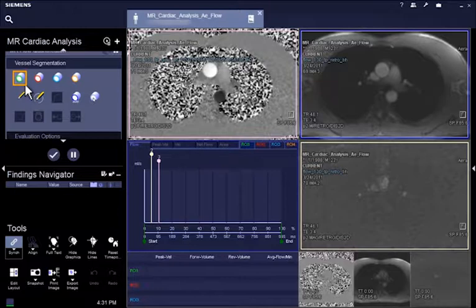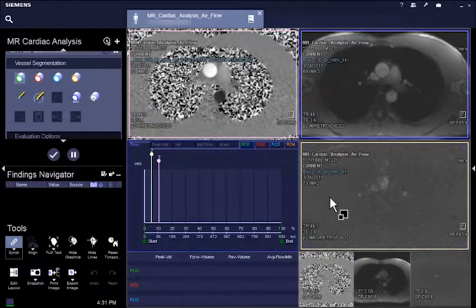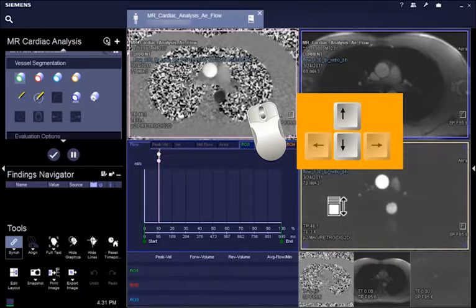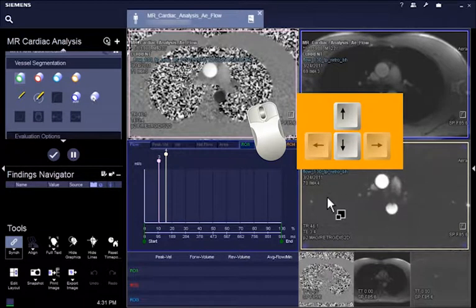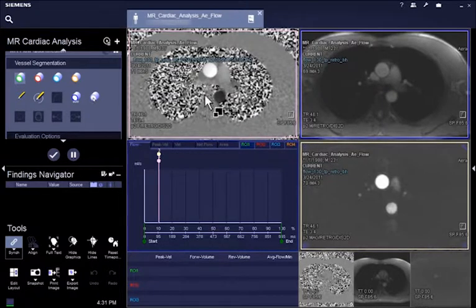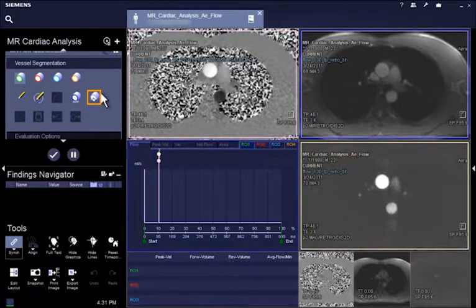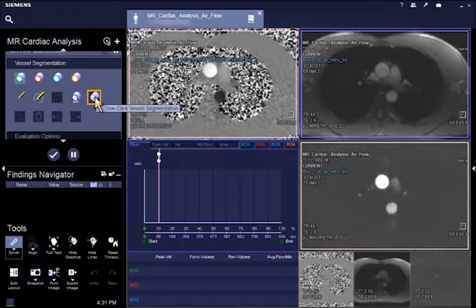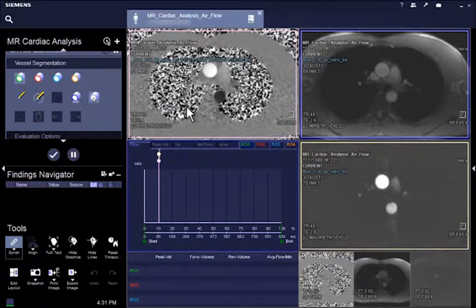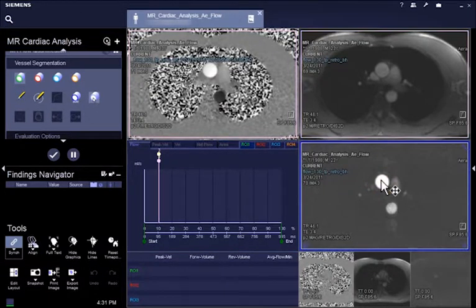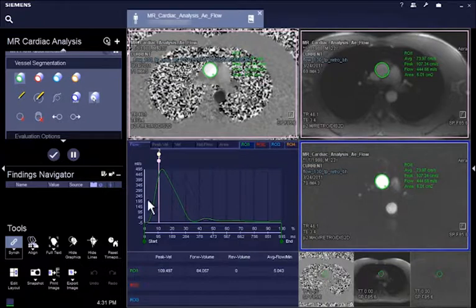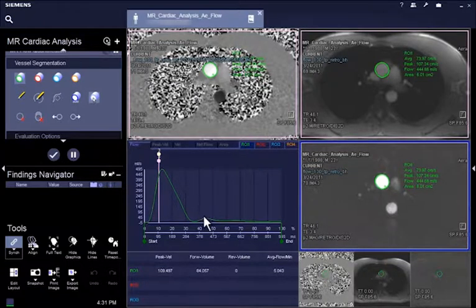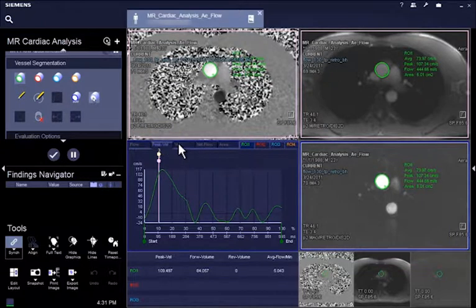All you need to do is to scroll through the relevant slices by using the arrow keys, up, down, or the mouse. Choose one-click vessel segmentation, and then with a click on the appropriate vessel, you can trigger an automated vessel segmentation, and the quantitative flow result of the corresponding vessel is displayed on the time flow graph.